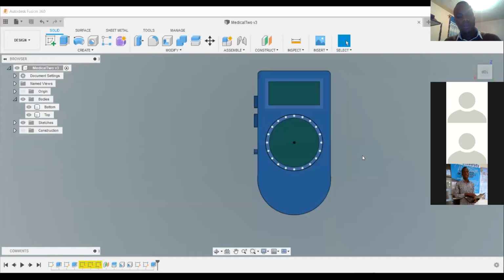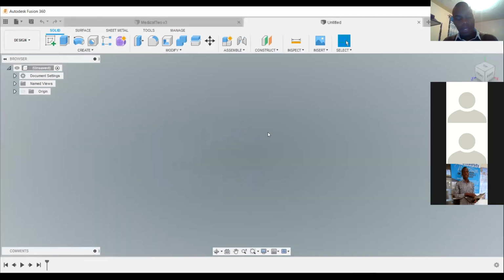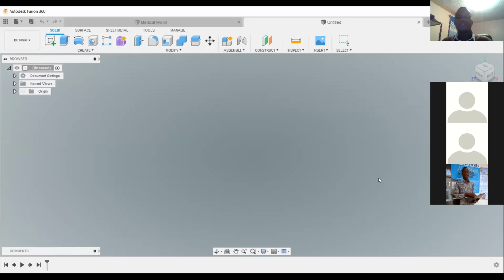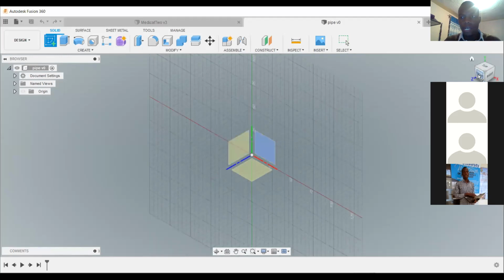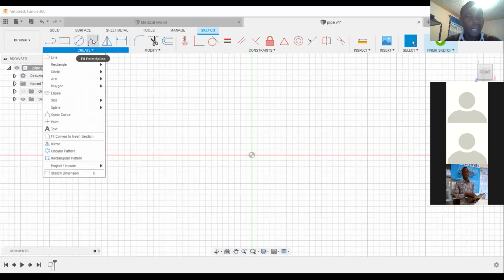I'm starting a new design. So file, new design. And then I want to call it pipe. So let's say we want to create a pipe. A pipe which is flexible, not rigid. So you can start a new sketch. You can design on whichever side you want. Then this is where you are going to do spline.